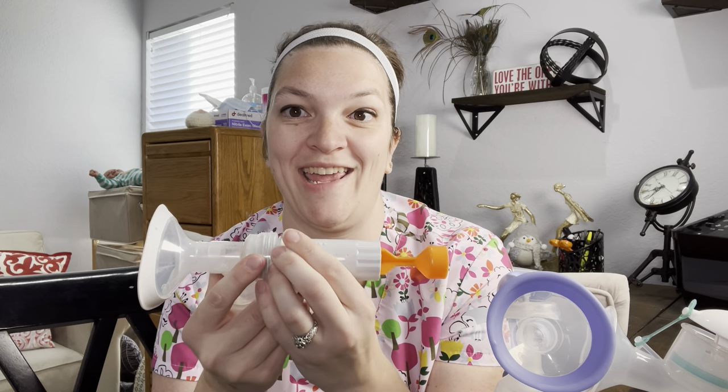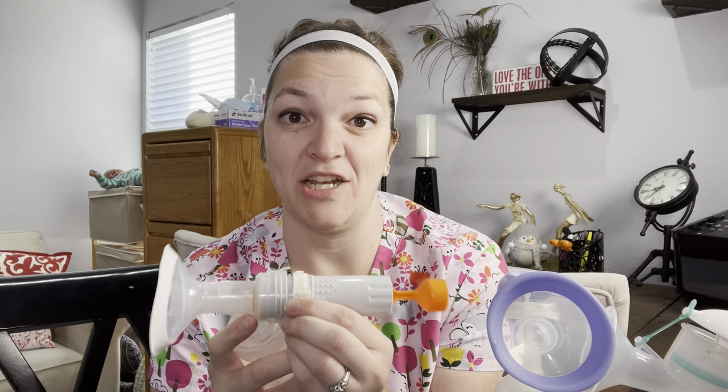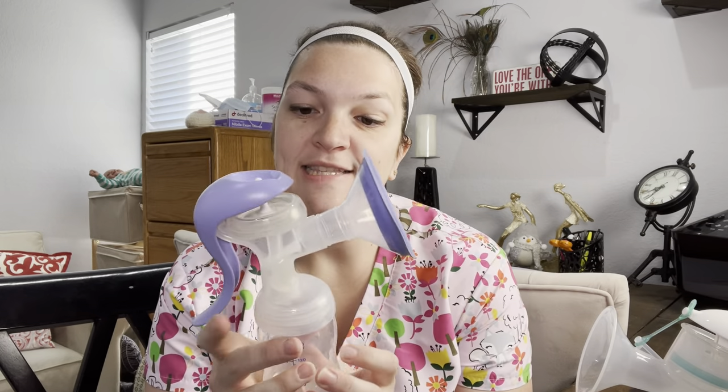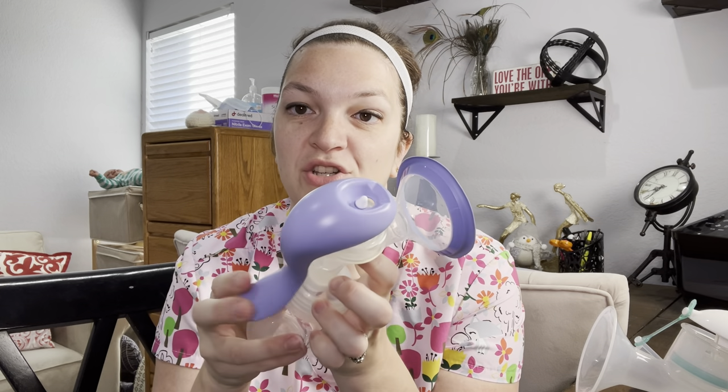It works the same as an electric pump in that you can change how strong the suction is to tell your breasts to either let down milk or express that milk. With other hand pumps like the Lancino, you adjust on the top for that strength — you move this piece to give you different suction strengths, and then you're controlling the cycle with your hands. A really quick flutter is going to give you that stimulation mode to help let down your milk, and a more rhythmical consistent pumping is going to help you express.